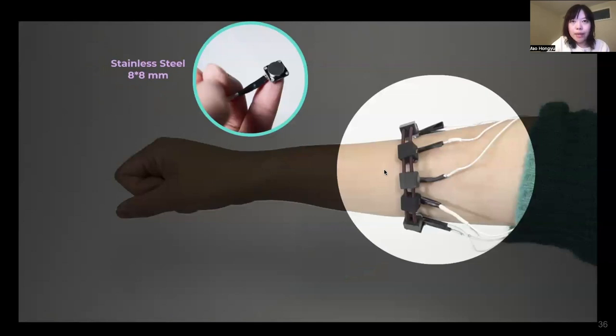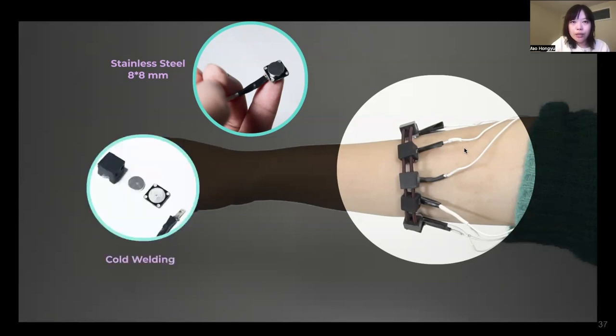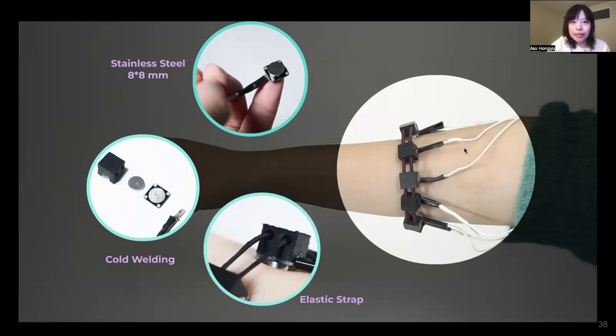For the armband design, our armband is made of only 8 stainless steel electrodes, which have a dimension of 8 by 8 mm and a thickness of 2 mm. To make it durable and relatively compact, it looks like a regular bracelet. The electrodes are interconnected with wires through cold welding technique and designed to interface with our sensing board. We then use an elastic strap to connect all the electrodes to allow flexibility and comfort for different arm sizes. The mechanical design of the armband will ensure good skin-to-electrode connection for people with different arm dimensions.